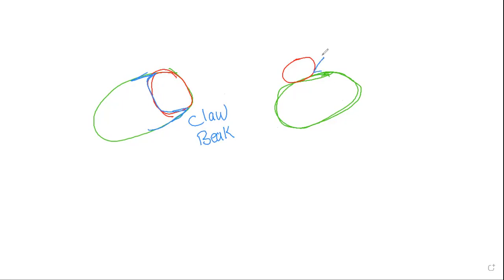We see this angle in between the cyst and the ovary. This way, if we can manage to see this claw sign or beak, then it is ovarian. If this is not the case, then this is para-ovarian. Okay, let's see it on ultrasound and see how it looks.